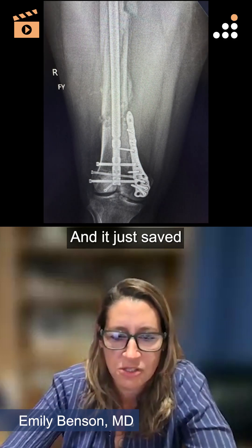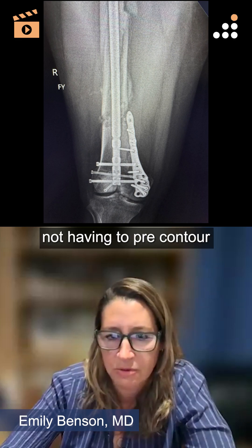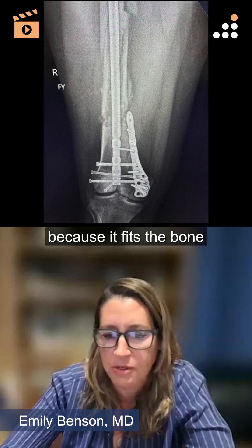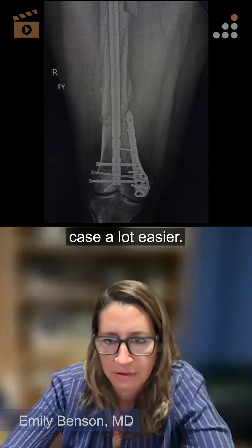It just saved a lot of time in this case, not having to pre-contour the plate. This plate has been kind of a game changer for me and my practice because it fits the bone so well and makes the case a lot easier.